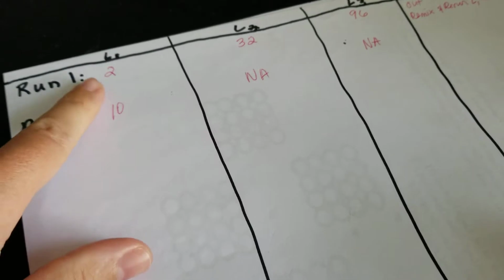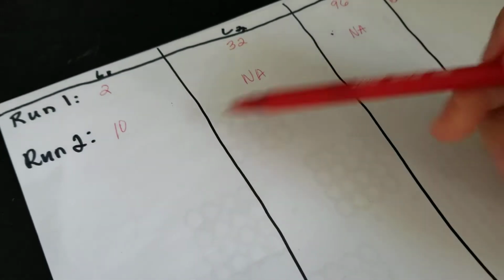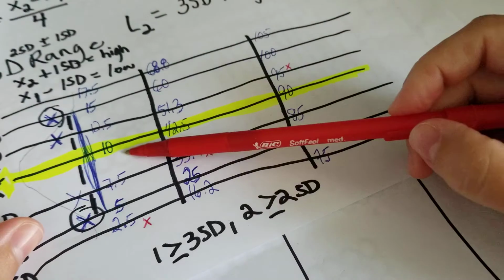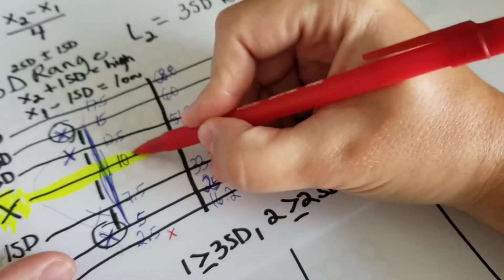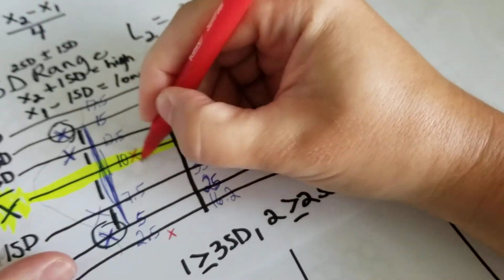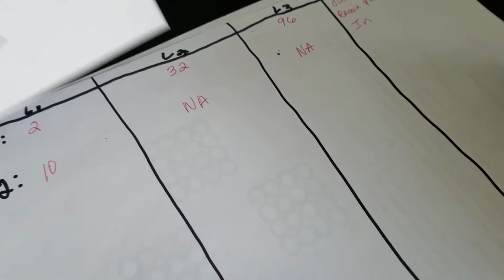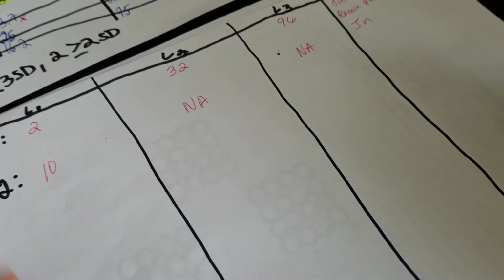Specimens, and then that's it. Okay, let's say that I re-ran my level 2, just like I said up here, remix and rerun level 2. And oh my gosh, it came in, okay? So it came in right on the mean. Hooray! At that point, you can just say that it's in and move about your day and start analyzing patient specimens.